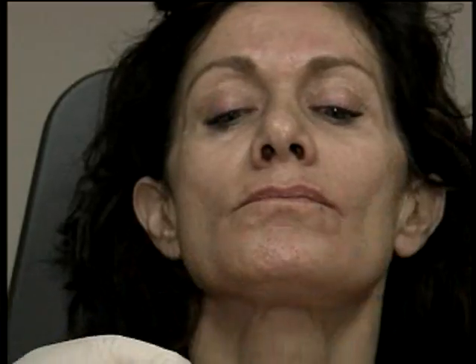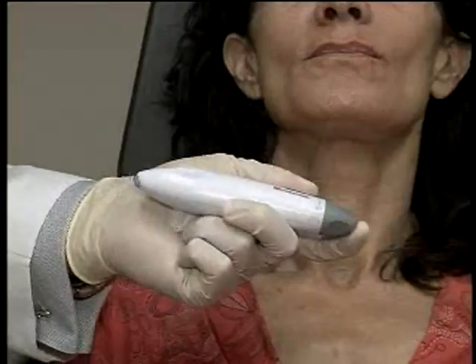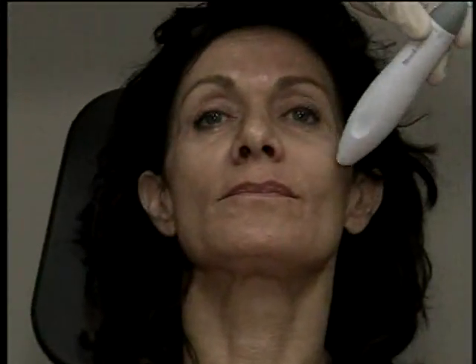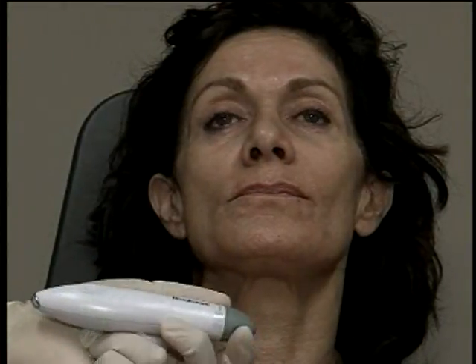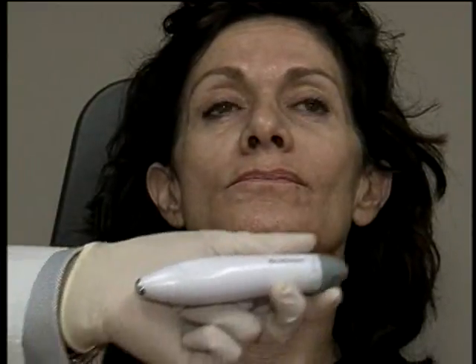Now, I have another trick, and that's using this. This is a little personal massager, and I don't have any financial interest in this company. But what I do is we place this onto the cheek, and we use it as a distraction device. It's a wonderful trick. Oftentimes patients will tell me they don't even feel the injections when I'm doing it. This works really great to distract the patient and the nerve so they don't feel the injection.